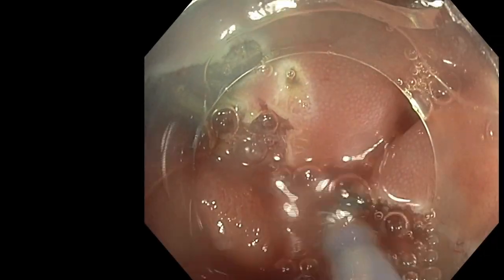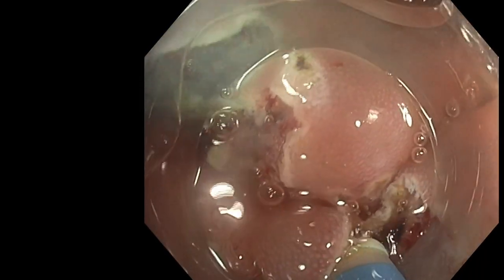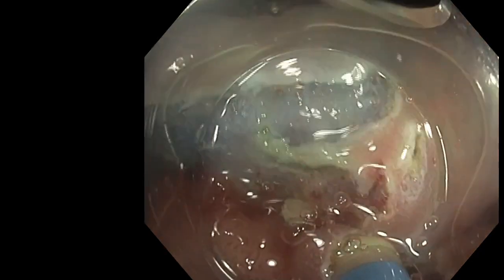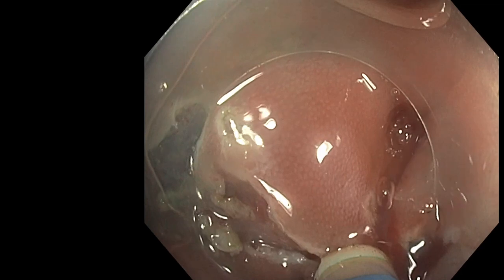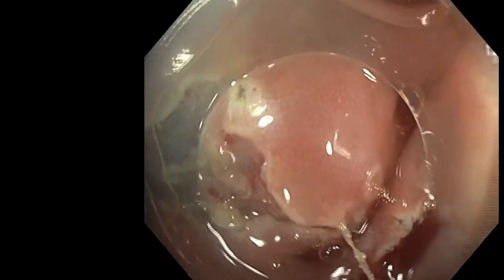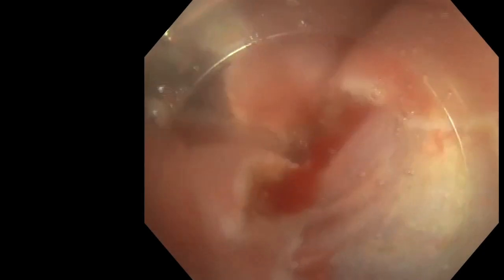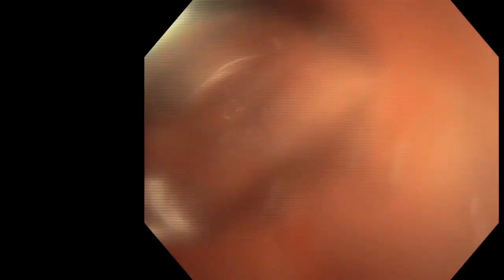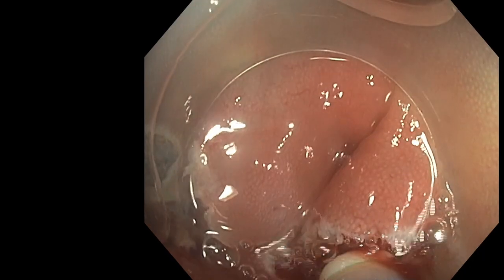It was only a diverticula on the edge, and you will see it will take time, because we have to go very slowly to go into the valley and obtain a cutting of the mucosa without damaging the muscle. So I have to pull back my knife, but you can see that we are very close to the diverticula entrance, and we have to go relatively slowly to open the space.